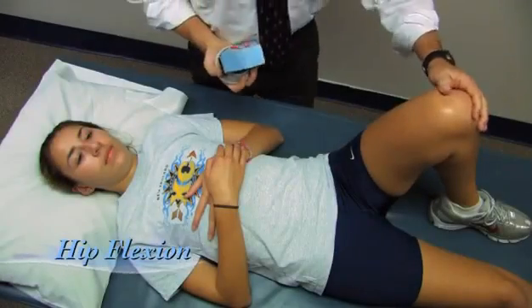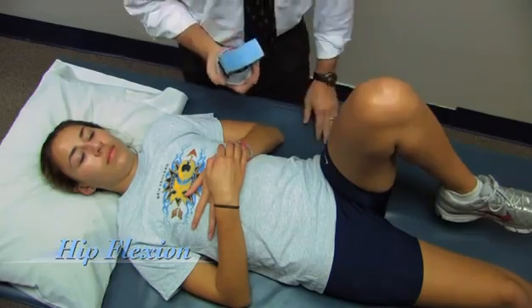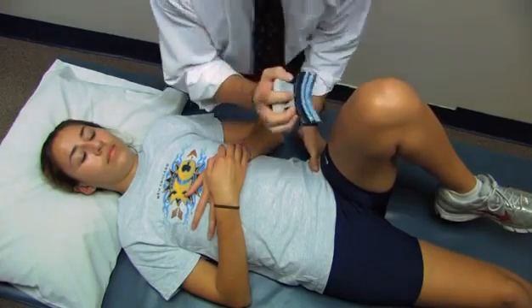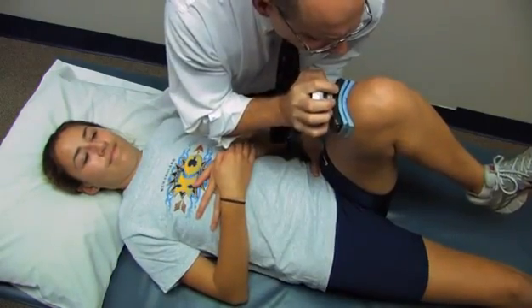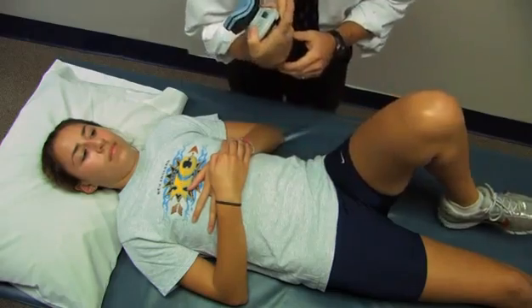Now we're going to measure hip flexion. This is done with the thigh basically in a vertical position, the hip at 90 degrees. I'm going to stabilize across the pelvis and place the device here. Take a second or two to come to maximum effort, then as hard as you can. Go ahead — pull up, harder, harder. And relax. We've got about 24 pounds.